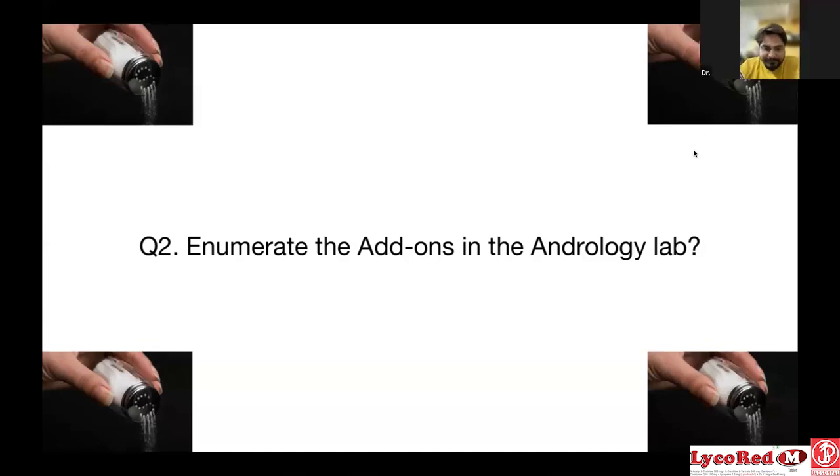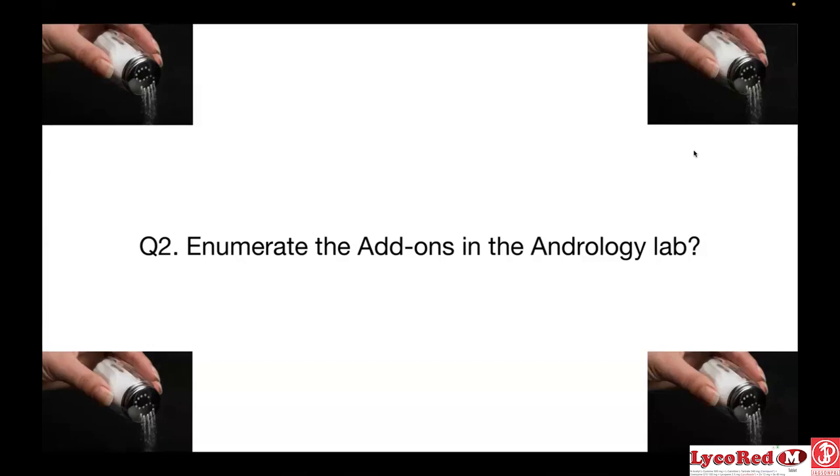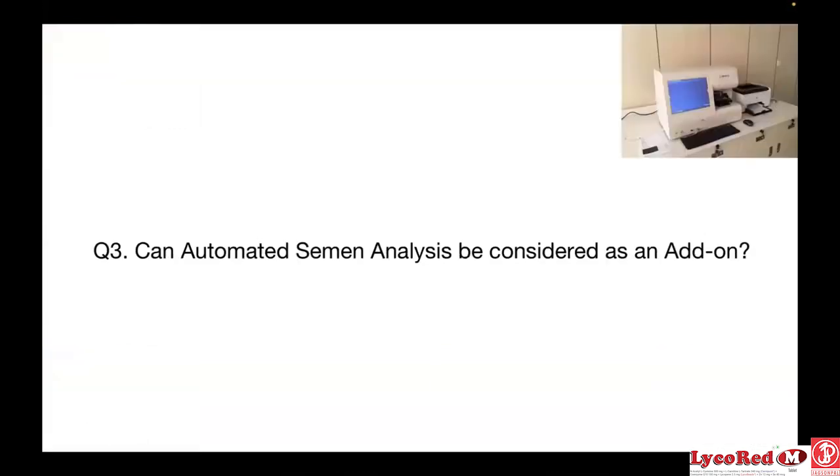Sir, automatic semen analyzers are very much available in the market. So we can lower the cost, and we can get test report results in very little time. There are many parameters we can get in 40 or 45 minutes. There are many benefits also.